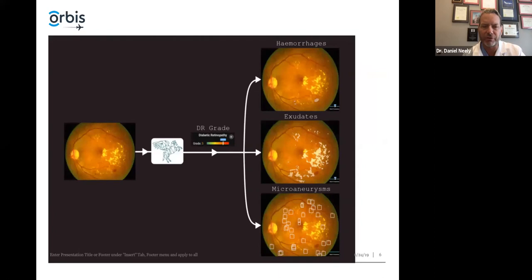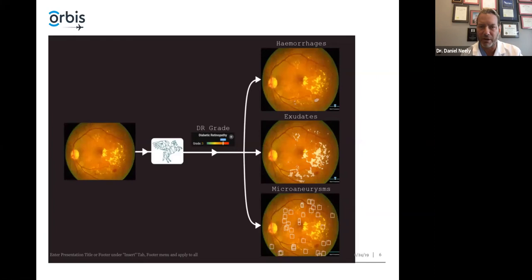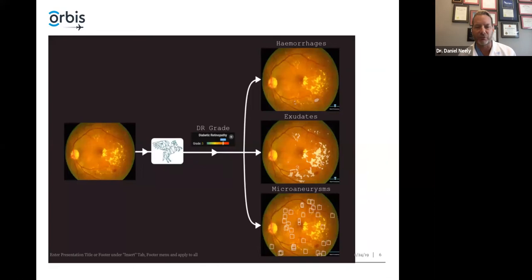Here's an overview of how the process works. There's an image on the far left which has been submitted — it has extensive exudates and a few hemorrhages visible. It gets submitted through the Pegasus software, which gives you a diabetic retinopathy rating and breaks it down, showing where the hemorrhages, microaneurysms, and exudates are specifically being analyzed.